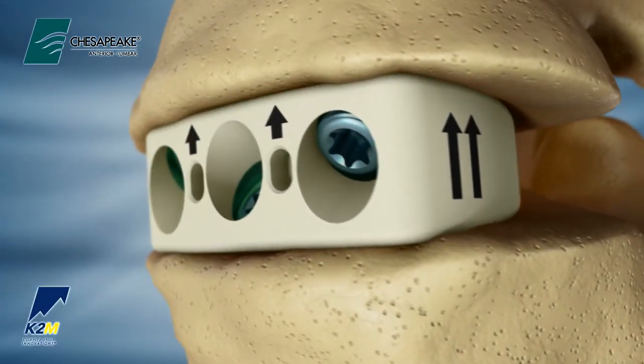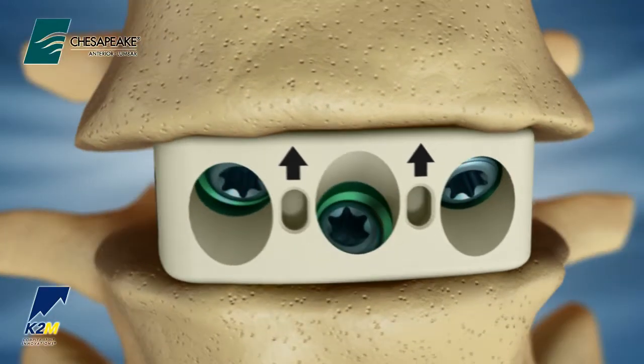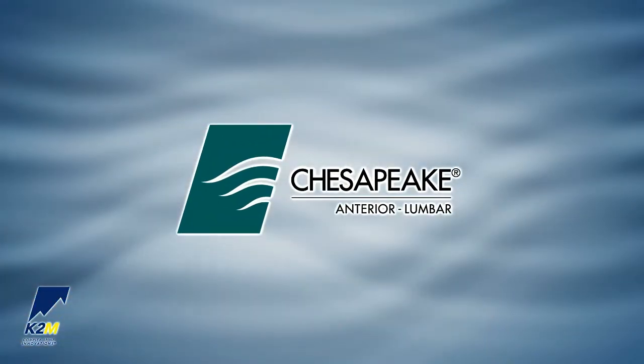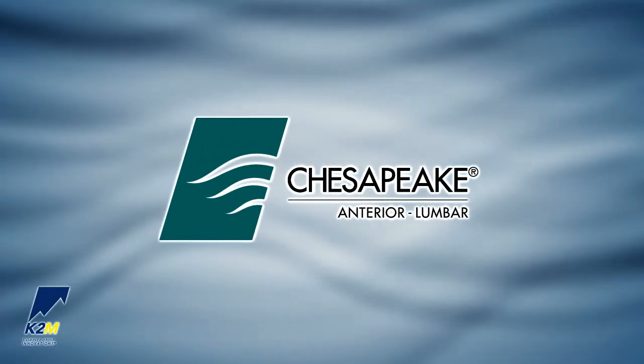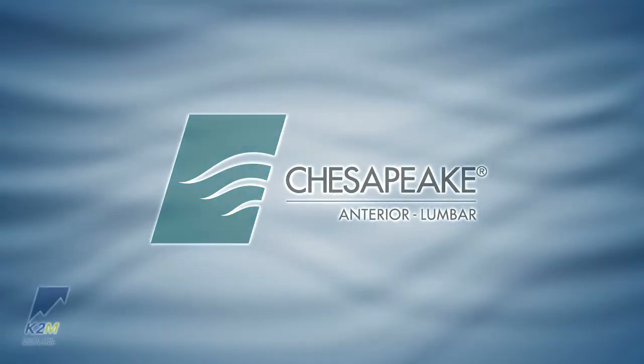Perform a standard multi-layer wound closure. The Chesapeake Anterior Lumbar Stabilization System from K2M. Complex Spine Innovations.